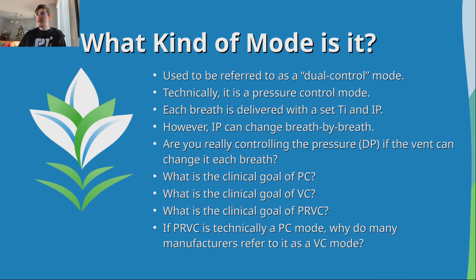Unless you're setting your high pressure limit to like 20 or 25, depending on the ventilator, you're really not controlling the driving pressure, are you? No, you're really not. Few questions here for you.